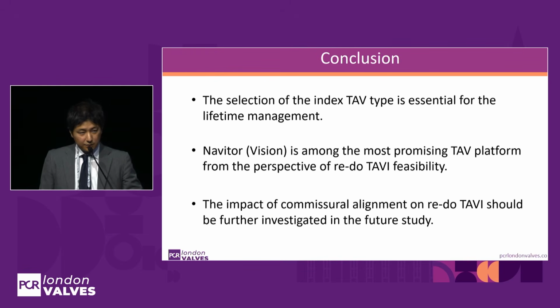So this is my conclusion. The selection of the index TAVI type is essential for lifetime management, and Navitor Vision is among the most promising TAVI platforms from the perspective of redo TAVI feasibility. The impact of commissural alignment on redo TAVI should be further investigated in future studies.